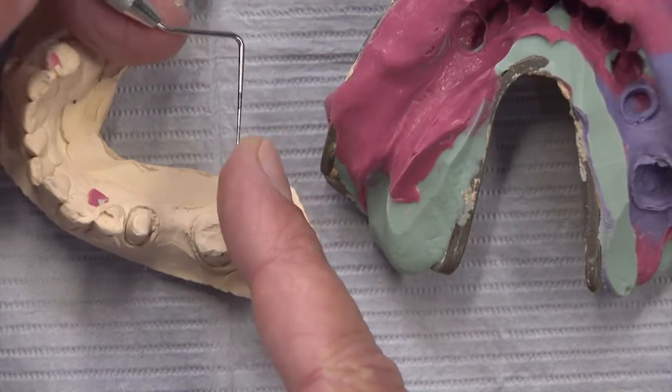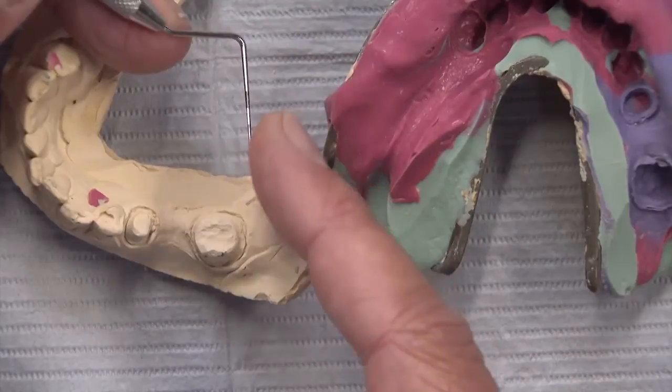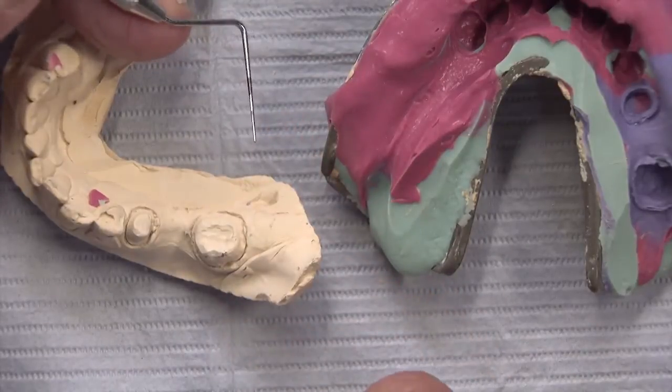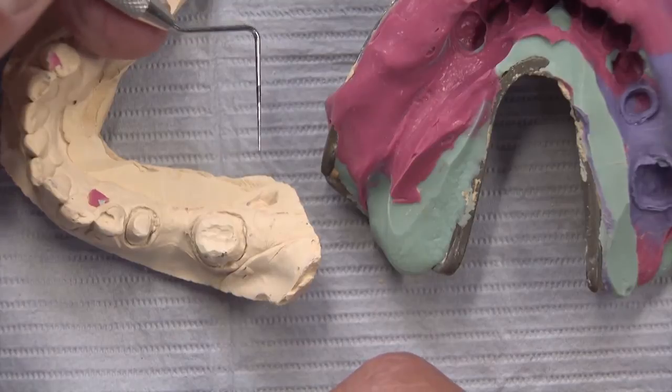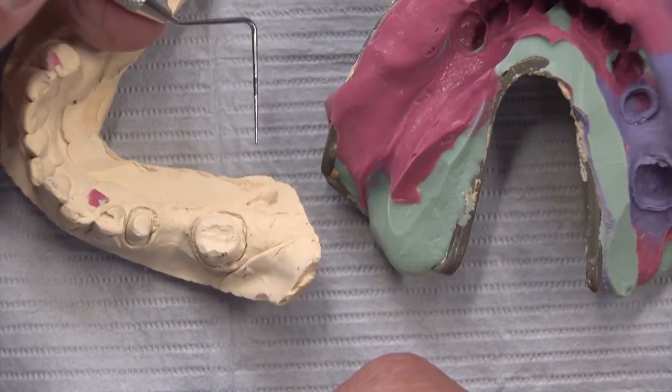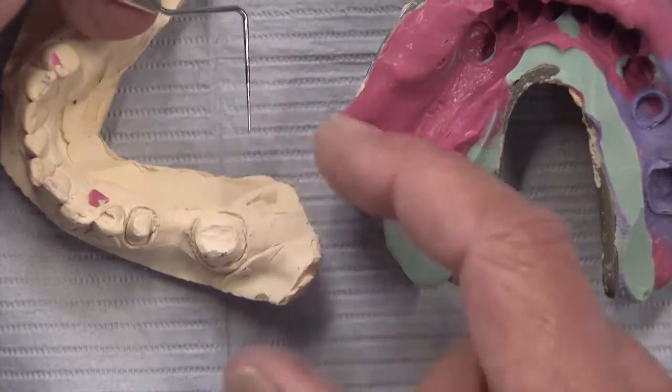Now, as you might imagine, if you tried to squeeze with a gun and squirt impression wash material out the end of this, it'd be almost impossible to do, and that's why it actually hooks up to your handpiece coupler, and you step on the rheostat and it's air activated. So the air activates the motor, which pushes the impression material out of this.